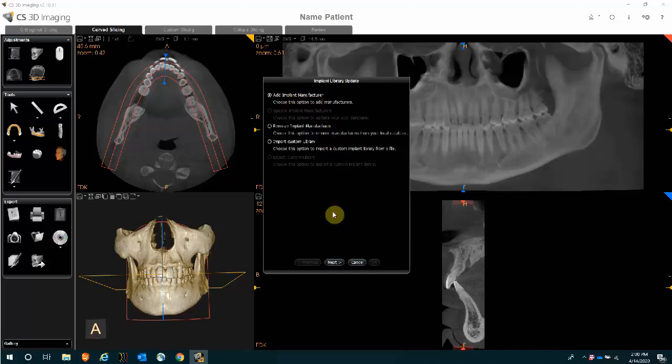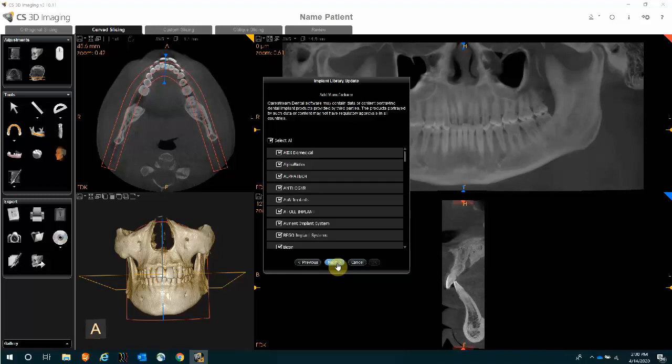All you would have to do is simply click Next. You are then presented with all the different manufacturers, and as a default, the software selects all of them.